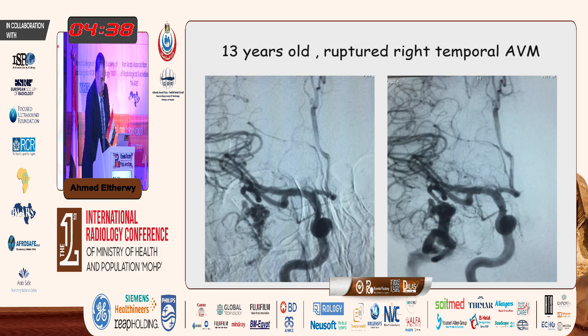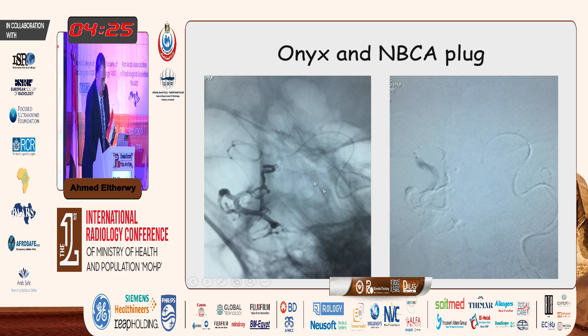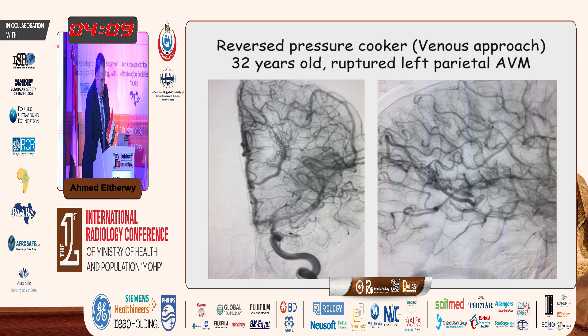A 13-year-old with a ruptured right temporal arteriovenous malformation. This is when we shifted to injecting onyx first. This is the first micro catheter — injecting onyx and then a very small reflux of onyx in the artery, and then here is the glue injected: the histoacryl-lipiodol emulsion. Then we can continue injecting until obliterating the AVM and obtain a complete cure. This is the post-embolization angio.